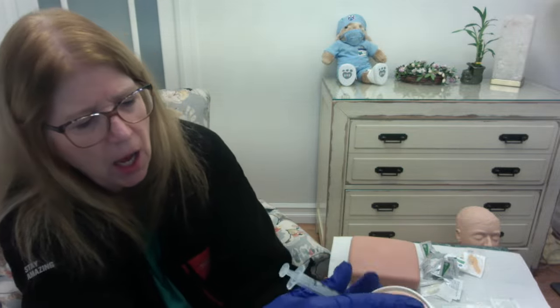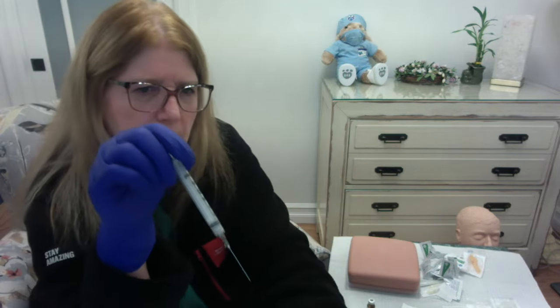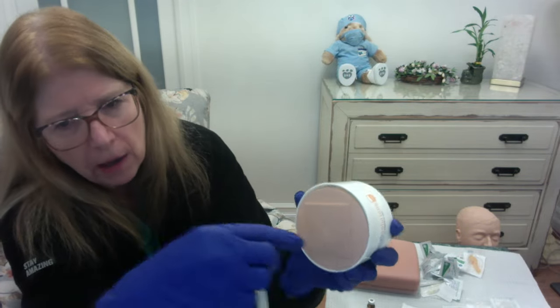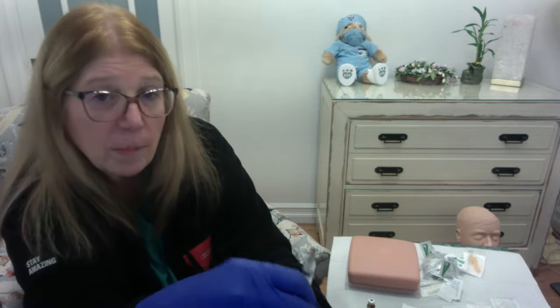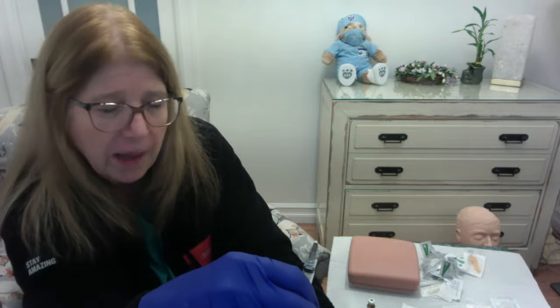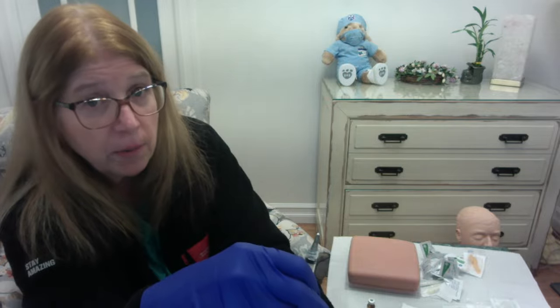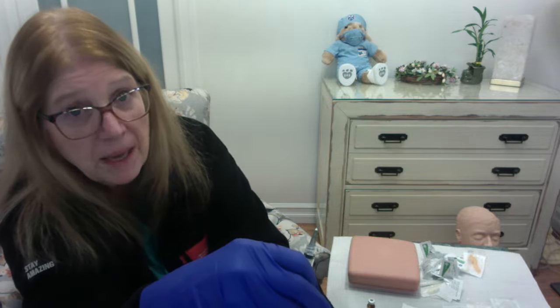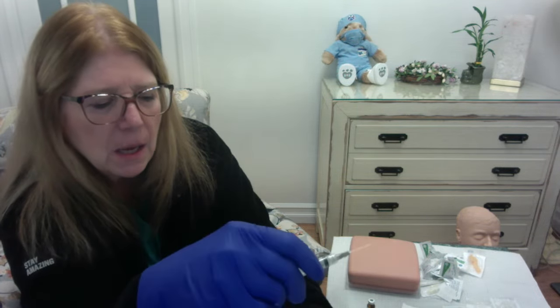I take the needle out, right? On the inside, I have created a track, right? Basically, I've created a straight track for the length of my needle. So medication could conceivably leak up that track into subcutaneous tissue. So for most medications, it's not a big deal. But there are some medications that are very irritating to subcutaneous tissue and therefore will cause your patient a lot of pain. So we want to try to disrupt that track and not have it be the straight track where the needle went in, right?